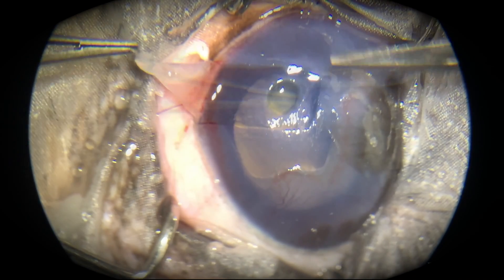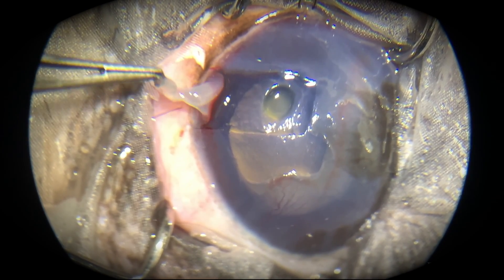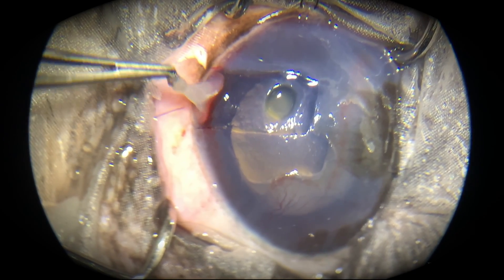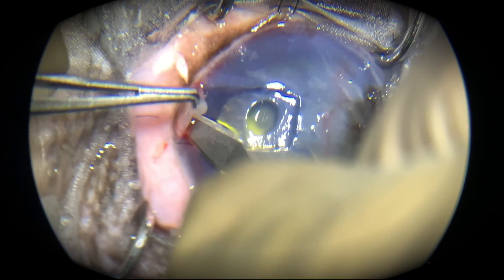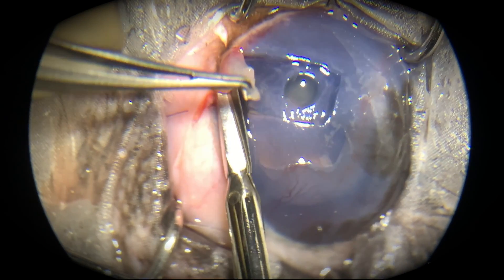The corneal portion of the graft has been separated after slicing through the cornea at half thickness. The desmetocele — that big hole — is still visible, but fortunately it is not full thickness. The success rate for this type of grafting, performed before the cornea ruptures, is very high.